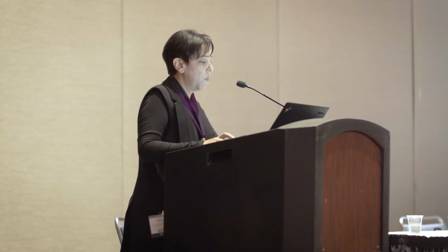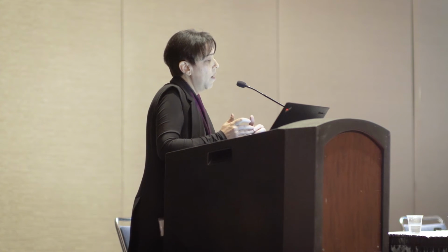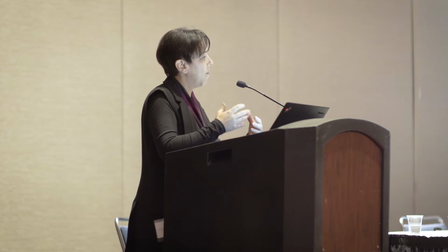So how do we move into MRD testing, and how does it actually work with our clinical samples? The first thing that we had to do for the validation of the assay was to establish the required input, assess the limits of detection, and also the rules and the workflows for the detection of MRD. One of the things that is important when you're doing these MRD assays is that you have to make sure that you don't have perhaps a minor contamination from the diagnostic sample, where you have the clonal sequence at a very, very high level.